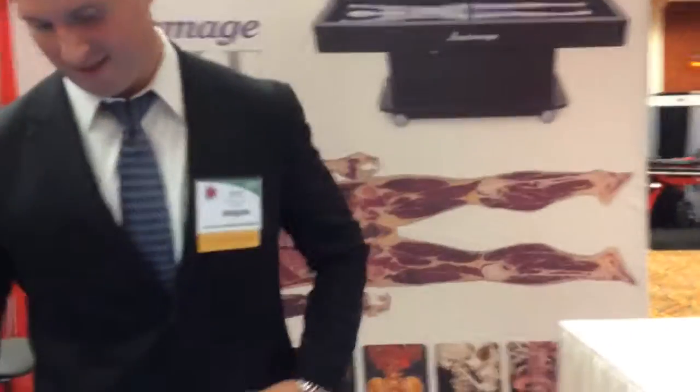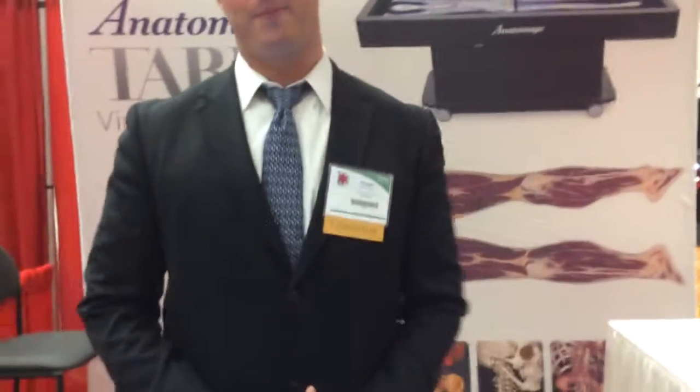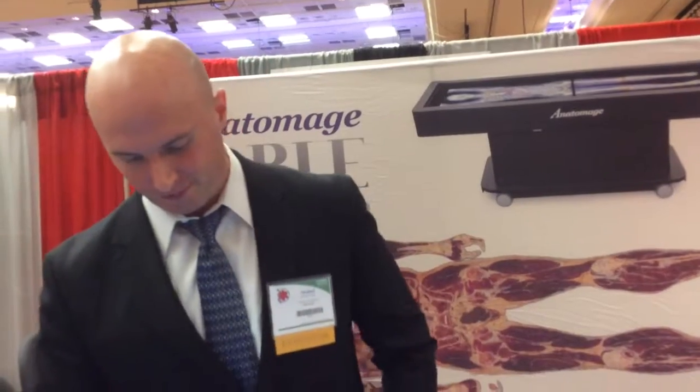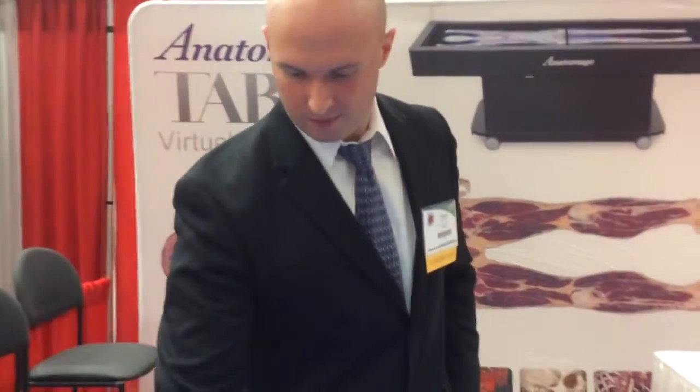Okay, so now you talked about students creating their own images. Do they throw a thumb drive into this thing and then take it out and put it on their own computer to review later? Exactly. Yeah, we have USB ports right here on the outside. That's cool. They can also do it through a network if you want to plug the table into a network through Ethernet.